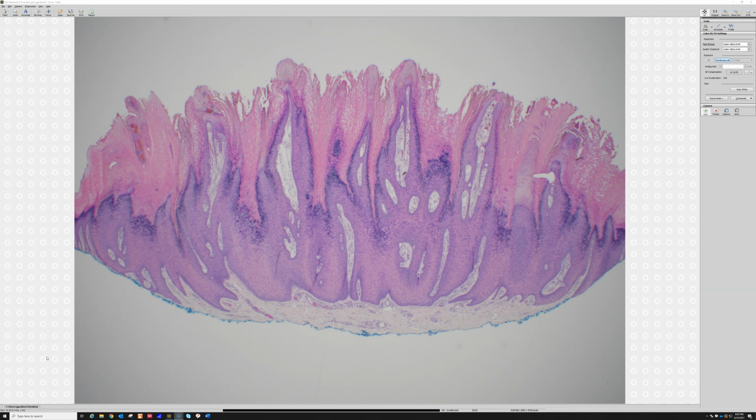So this is a really perfect prototypical example of a verruca. Not every verruca will have every feature that I'm going to show you today. So I'm going to teach you all of the different major features. Once you recognize it on a perfect example like this, you can begin to recognize verruca that is more subtle and not as classic, okay?